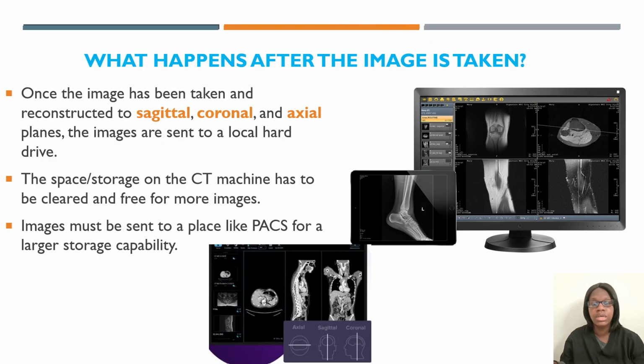So whenever you send the images to PACS, the images are there because PACS has a large storage capability. So before you delete images from the CT machine, make sure that it has been read in PACS or on their report in their chart. And do not delete the images from the same week or month in case someone needs to look it up, like by the patient's name. I know a lot of CT students sometimes rely on that MRN number, that medical record number, or a session number to write down on their paper for documentation. And then you just never know.